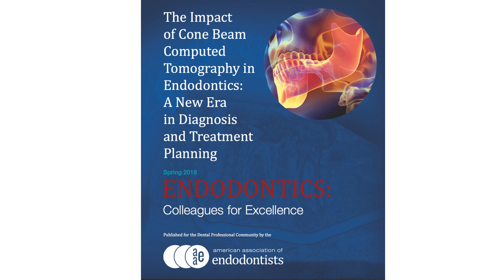The American Association of Endodontists put together the Colleagues for Excellence newsletter in the spring of 2018, and they discussed the impact of cone beam computer tomography in endodontics, a new era in diagnosis and treatment planning. They didn't include treatment, but definitely during treatment, a CBCT scan can be needed.